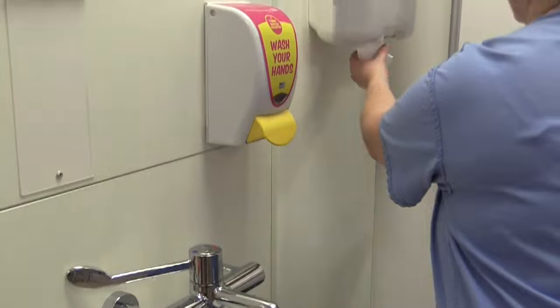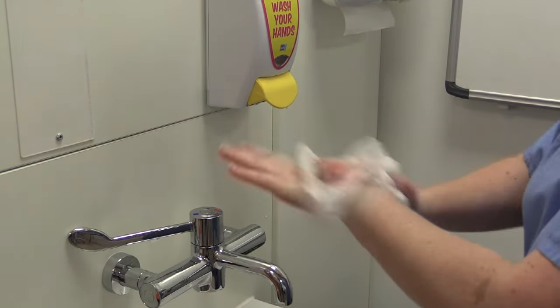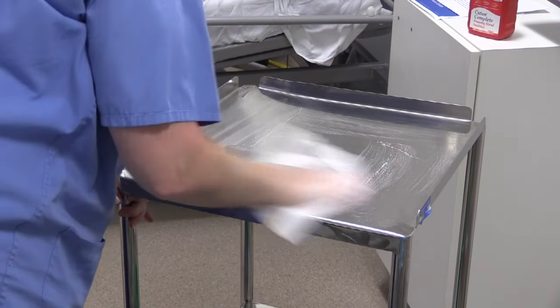Do they have any concerns or questions? Have they got any allergies? Maintain their privacy and dignity whilst achieving a comfortable position with the use of a pillow if necessary. Check their ID bracelet or use three-point verbal ID.